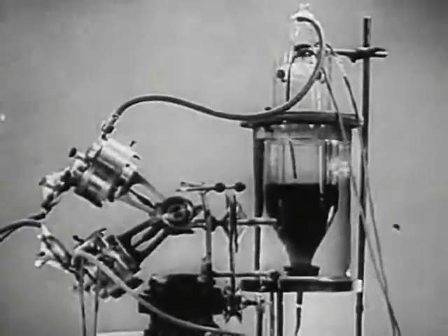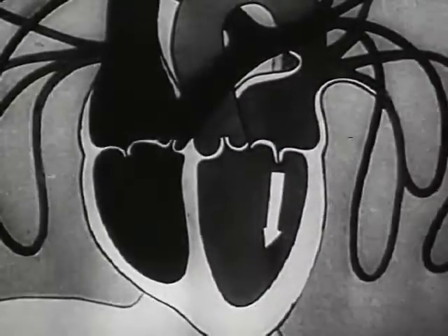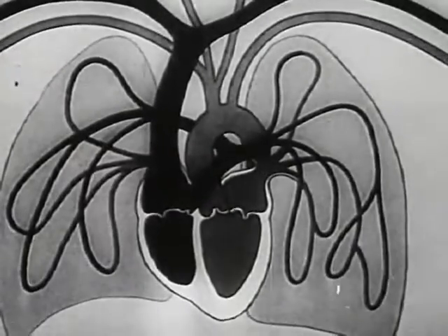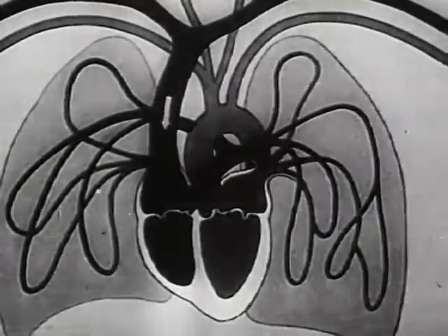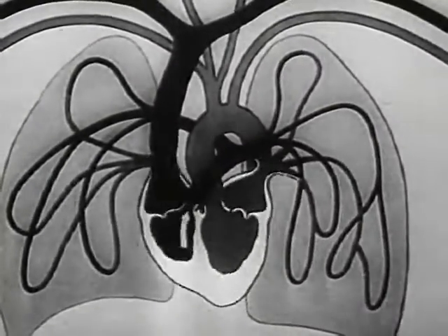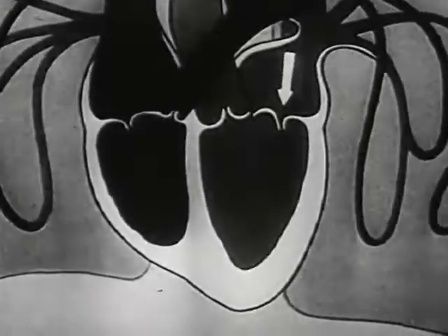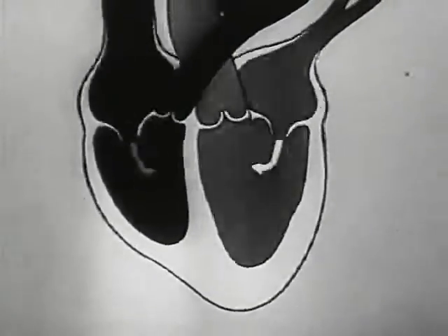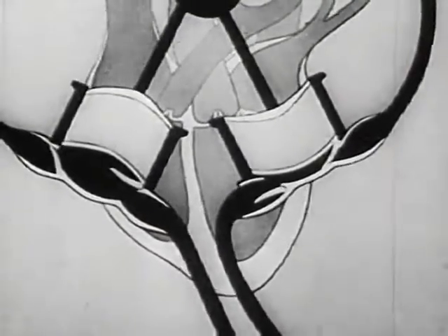The auto-ejector carries out the functions of the heart and lungs. As we know, the heart, by its rhythmical contractions, supplies the body with arterial blood rich in oxygen. After losing its oxygen, the blood returns to the heart through the veins. From them, it flows into the lungs, whence with a fresh supply of oxygen it returns to the heart, and thence flows into the arteries of the organism. The auto-ejector works on the same principle.